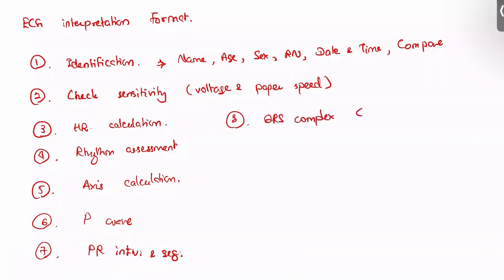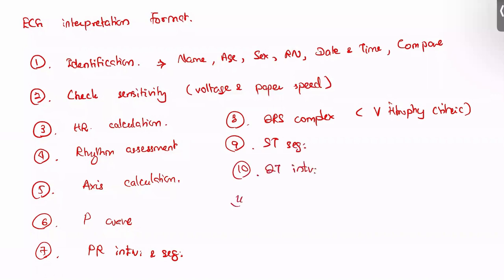At the same time, we have to look for the ventricular hypertrophy criteria, ST segment, QT interval, T wave, and also changes specific to specific diseases.